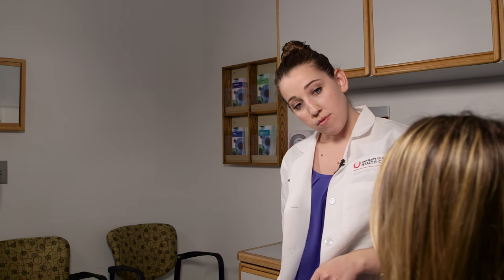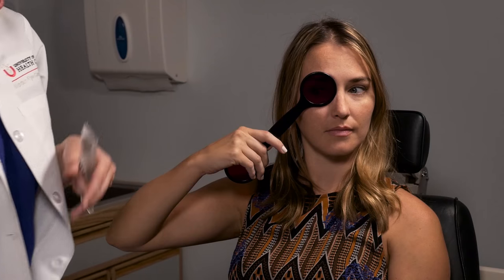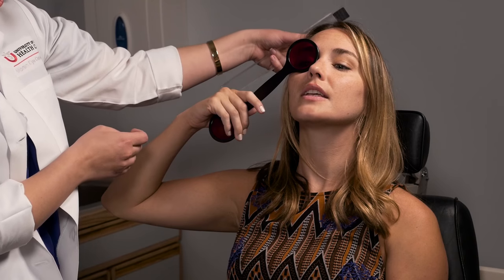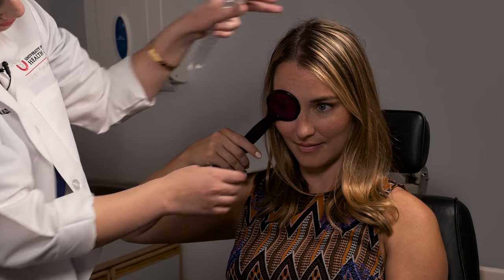This is measuring her in left gaze — go ahead and look back at the light. Is the light above or below the red line? Right on it — perfectly aligned. And how about in right gaze? Right on. Very good. You can also do it in down gaze and up gaze — right on it.